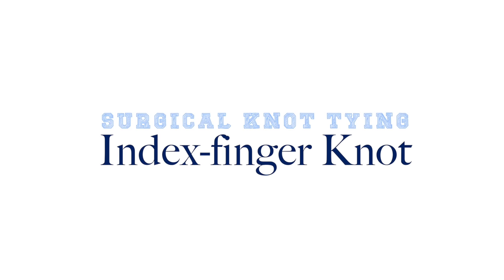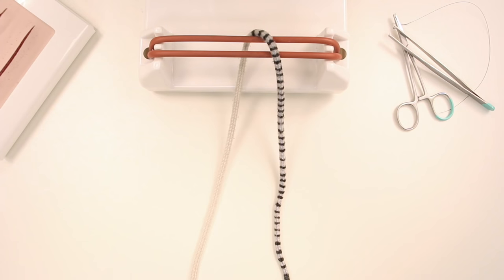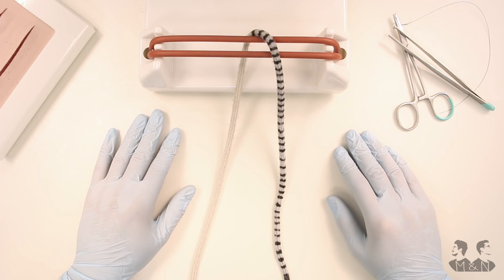In this video we are going to show you how to tie a surgical knot using your index finger. For a correct orientation of the final knot, it is necessary to hold the upper filament in your right hand. And this is how it looks like.